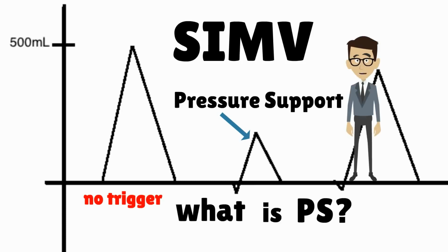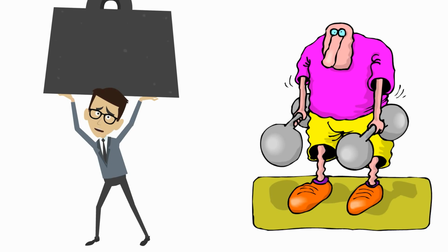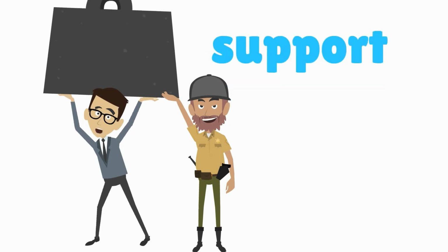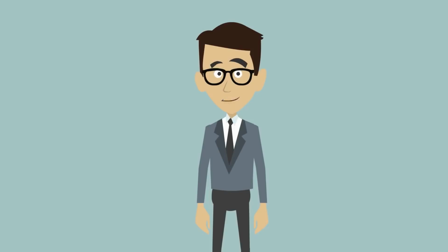And what is pressure support? Let me explain. If you've ever lifted weights, understanding pressure support is easier than you think. If you're spotting someone who is struggling to lift, what you're really doing is you're supporting them. If they need a little help, you provide a little support. But if you have to give too much support, your friend probably should not be lifting the heavy weights. Well, the same principle is true with SIMV.